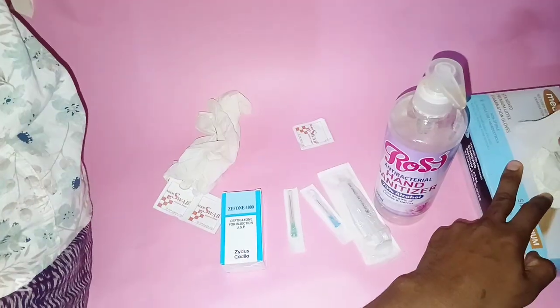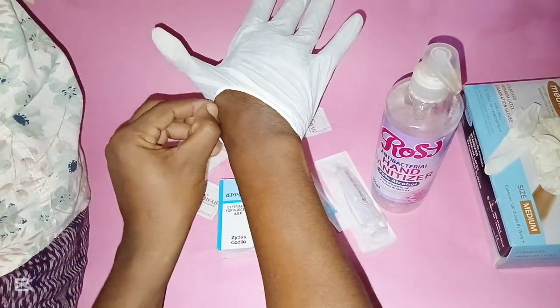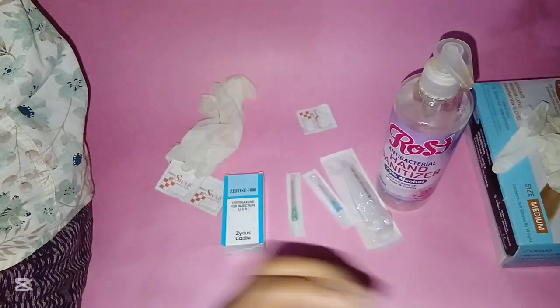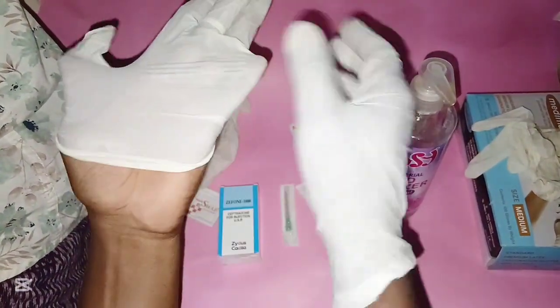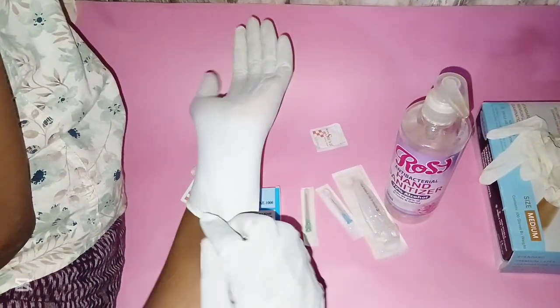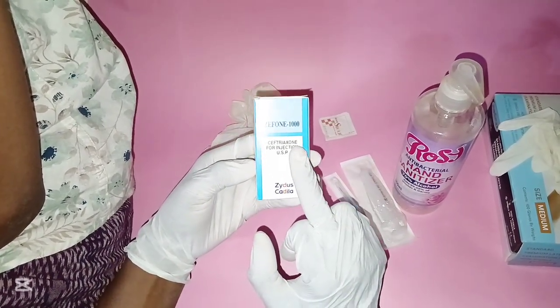Then don the gloves — make sure you wear gloves first. Once gloved, get the IV drug medication.